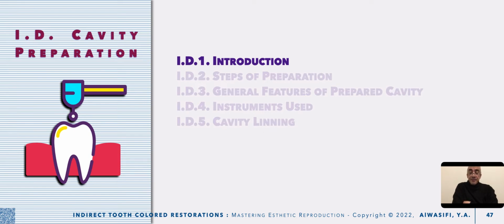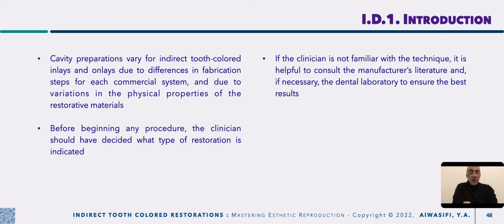Let us start by stating that cavity preparation for indirect tooth restorative materials varies greatly in its fabrication and in its specifications from system to system, meaning the commercially available systems, due to the variation in physical properties of the available materials.